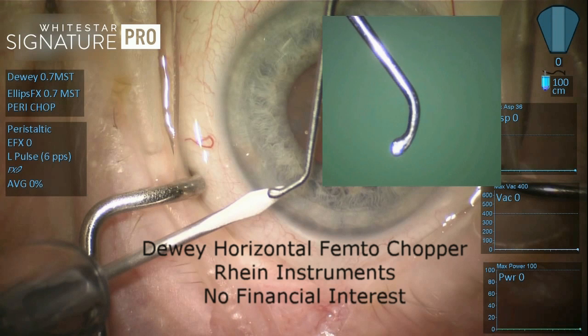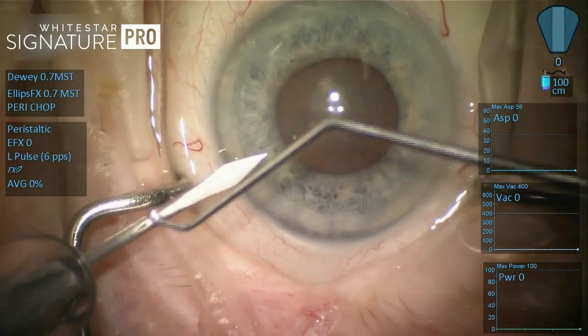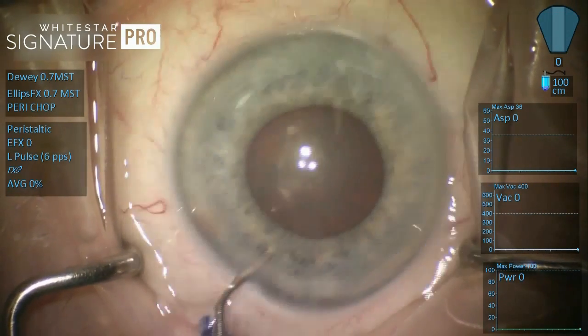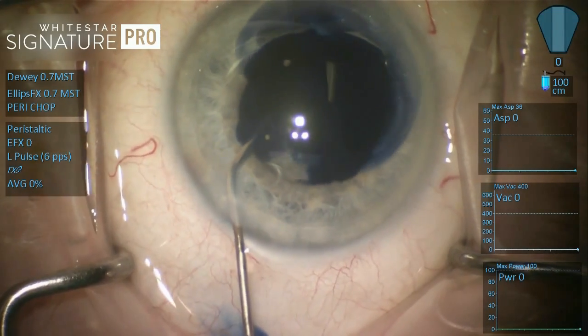So I kept the internal configuration to wrap around the equator of the lens for performing a horizontal chop, but the tip is the same size as the shaft, and this goes into a 23 gauge incision, which provides a beautifully stable, non-leaking side port incision, but unfortunately does require ever so slight enlargement just to get the viscoelastic cannula through.